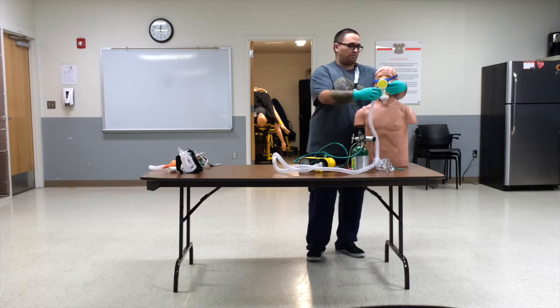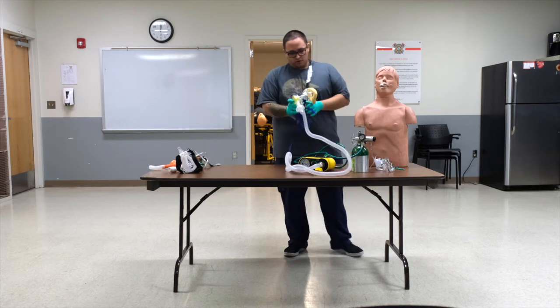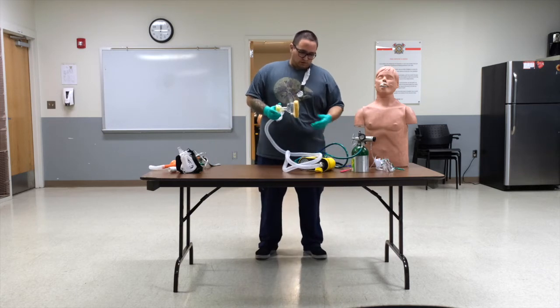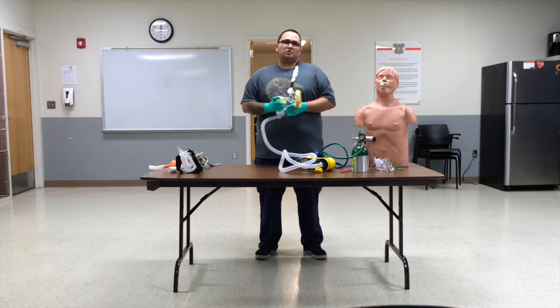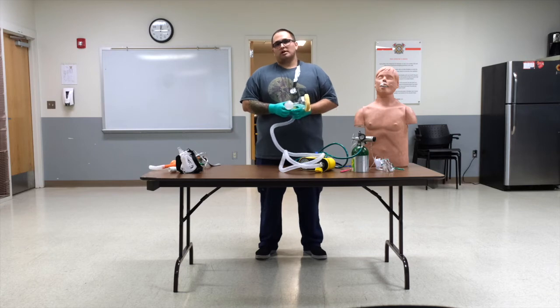And that is CPAP. Something else with CPAP as well that we talked about in another video with neb treatment, we can also do inline nebs with the CPAP as well. So key for CPAP is making sure, 1, we have a good seal, 2, that there's no contraindications, and making sure that the patient is tolerating the therapy.